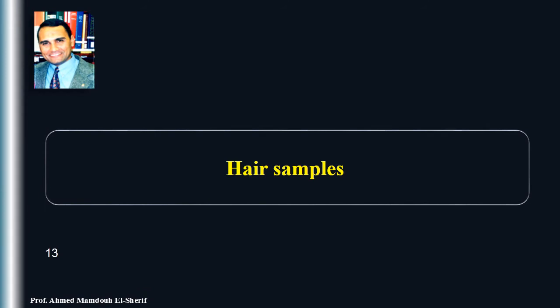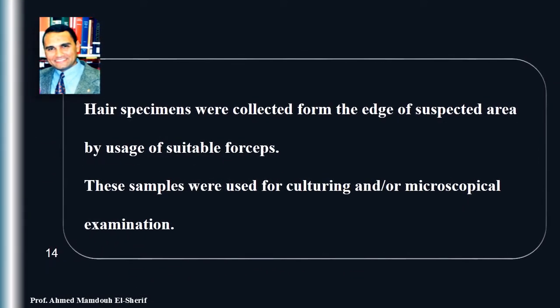Hair samples. Hair specimens were collected from the edge of the suspected area by usage of suitable forceps. These samples were used for culturing and or microscopical examination of these hair shafts.